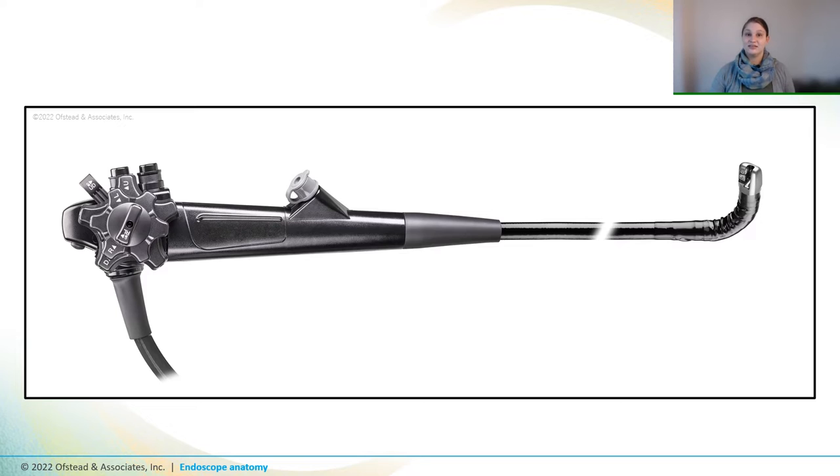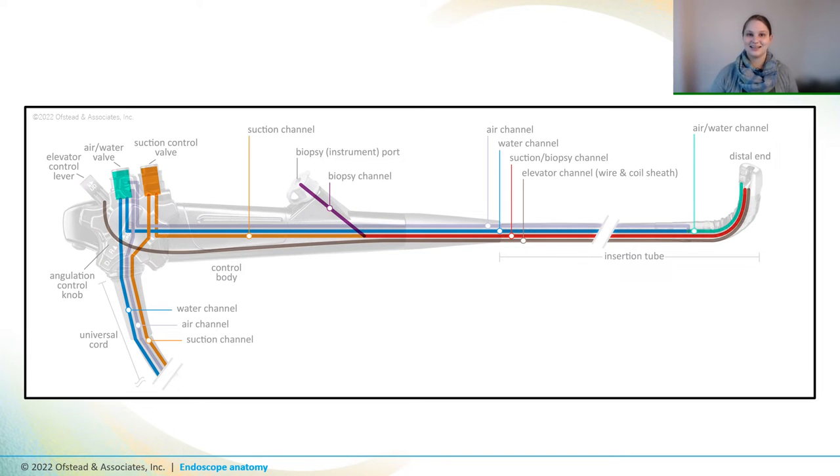Now, from the outside, you might think that an endoscope is just like a hose with a fancy handle, but there's actually a lot going on on the inside. To give you an idea of what's going on inside a complex scope like a duodenoscope, our graphics guy made this cutaway so you can take a peek inside, where the control handle and insertion tube house channels for air, water, instruments, and the elevator wire. If you're a sterile processing or endotech, you have to make sure to get all of these channels and ports clean before you try to sterilize or disinfect the scope.